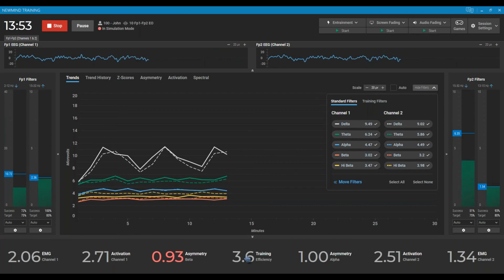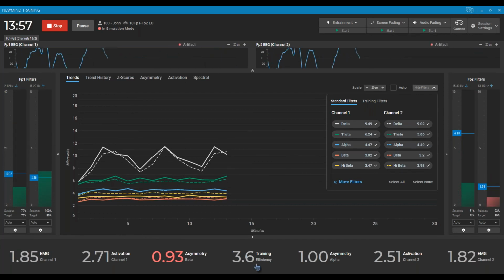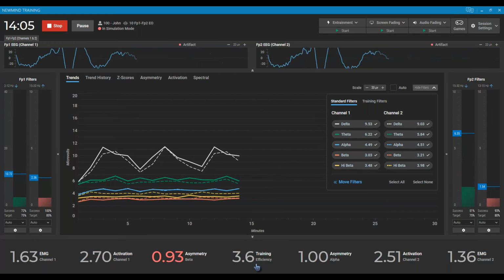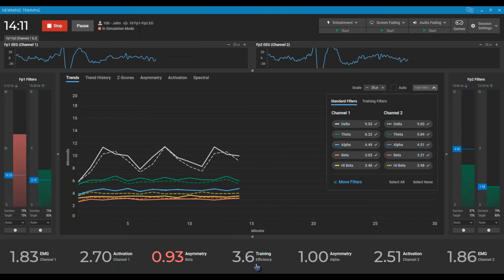I agree. Typically, those are a little bit below 5, and the single channels are usually about 50 or better. And the 2 channels, like you said, between 5.0 and 30 is the range you want to be in, and that 15 to 20 range is probably ideal.